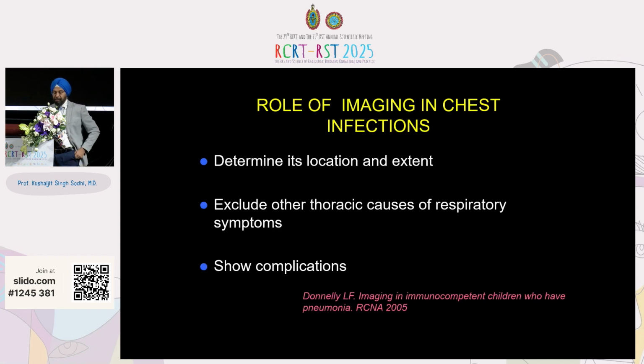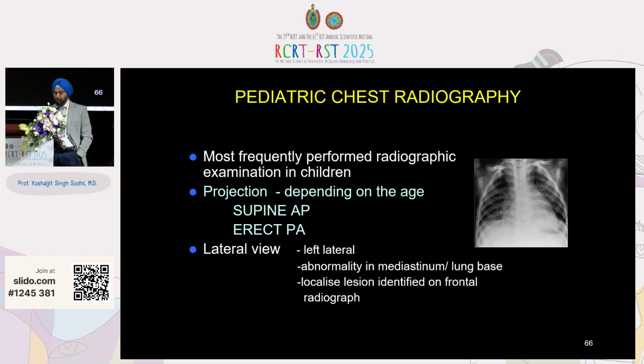So what is the role of imaging in chest infections? As a radiologist, our role is to determine the location, the extent, and look for complications. The main indication of most of the radiological diagnostic tools is to look for possible complications in children with infections. Most of the viral infections would not involve any radiology at all, and they heal by themselves in 5 days or a couple of weeks' time. It's the complications we are more worried about.